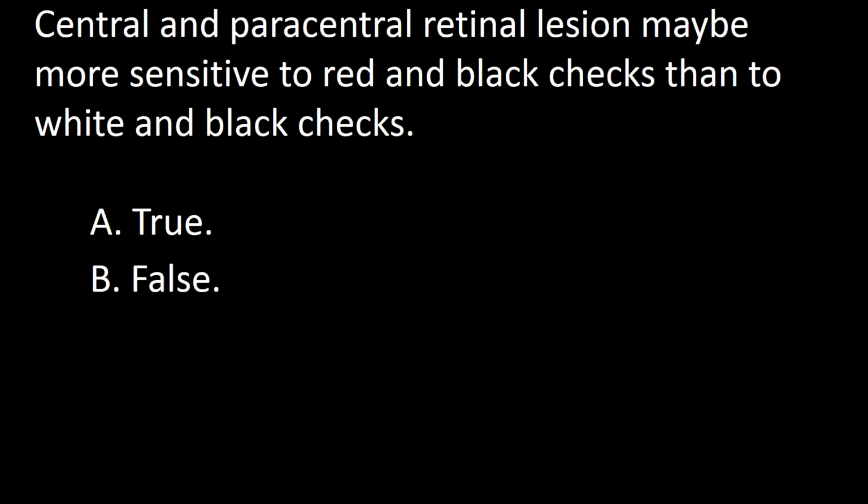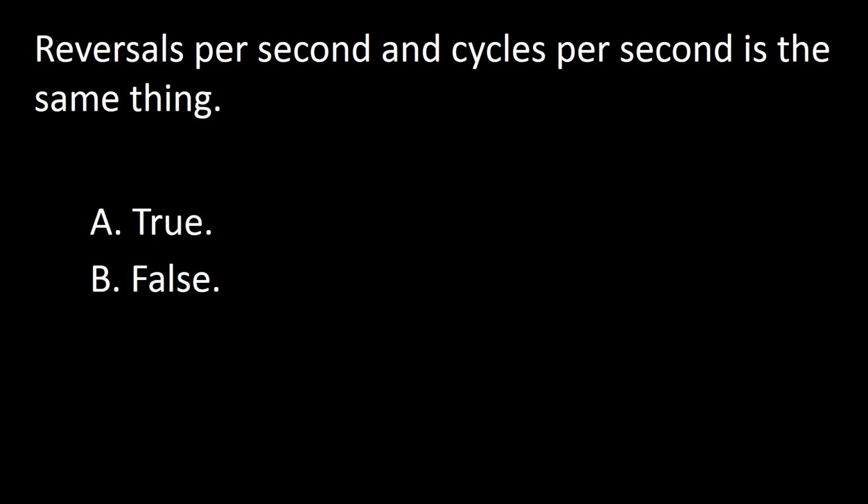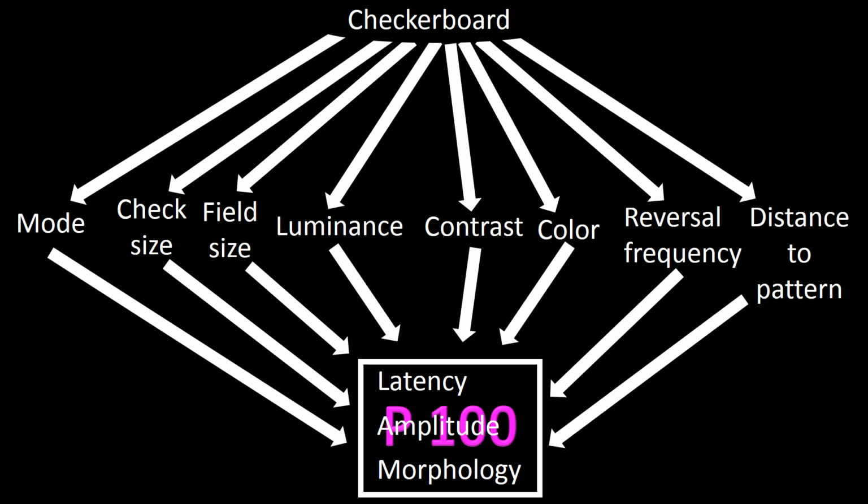So the answer to this question is true. Next question. Reversals per second and cycles per second is the same thing. A true, B false. Another factor that greatly influences P100 is reversal frequency.